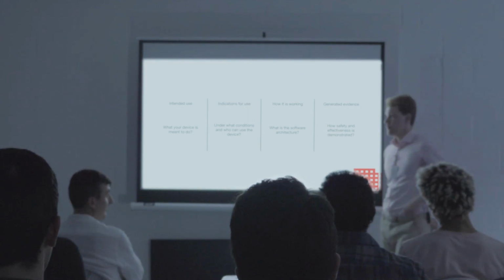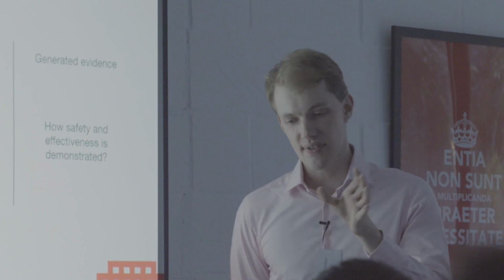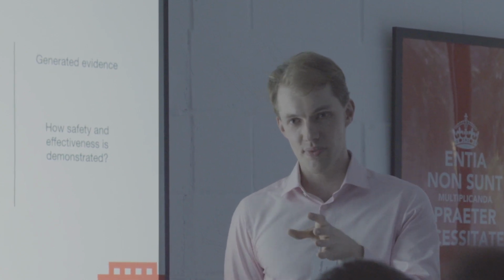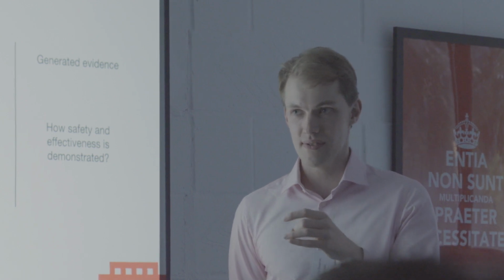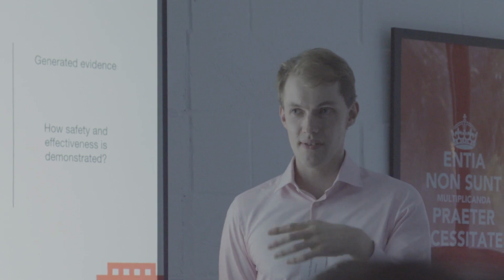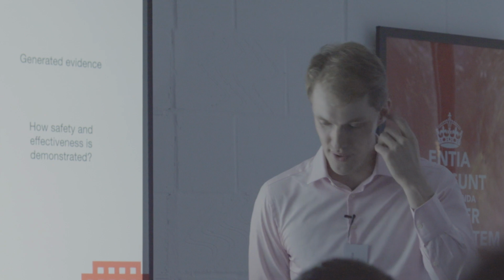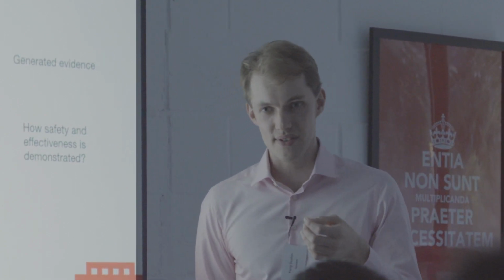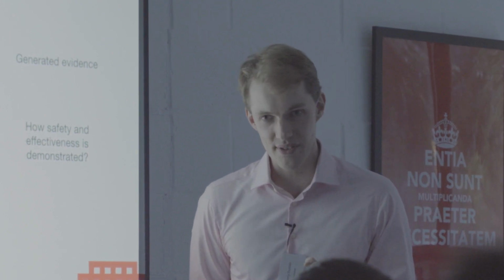There are so-called reference standards. I think it won't be a gold standard because it is subjective, but it's a reference standard. What it means by reference standard is the best tool out there, but there might be other tools that are just standards. What we would use as a reference standard, for example, for Parkinson's disease, is the MDS-UPDRS, which would be a reference standard for movement impairment.